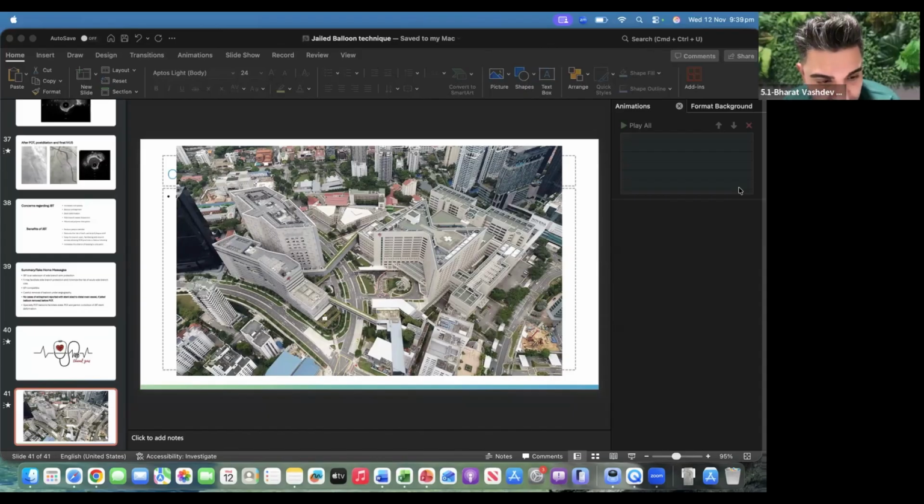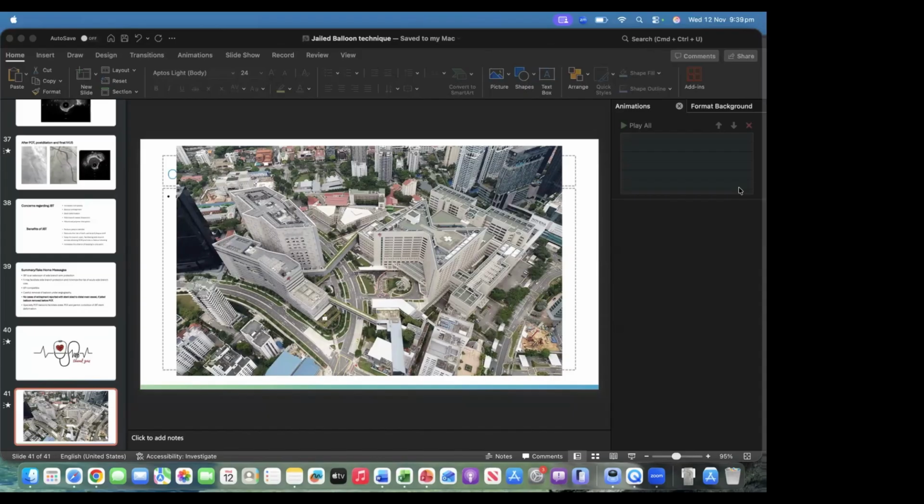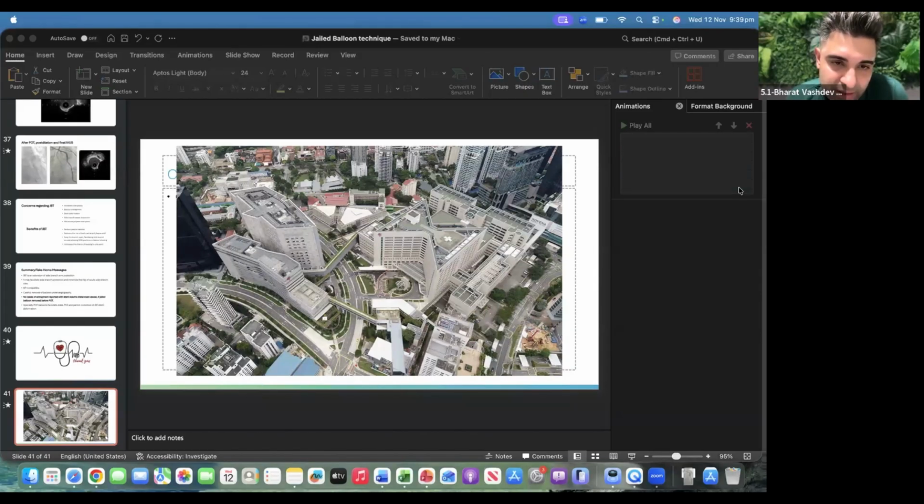That's a very good point. Yeah, I think if you've had a lot of trouble to get into the side branch, then you want to minimize the potential risks of that side branch actually getting more pinched off or actually losing that side branch. So it's something that I might employ. My cutoffs usually are about 3.